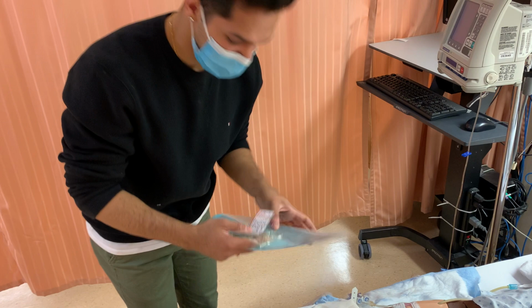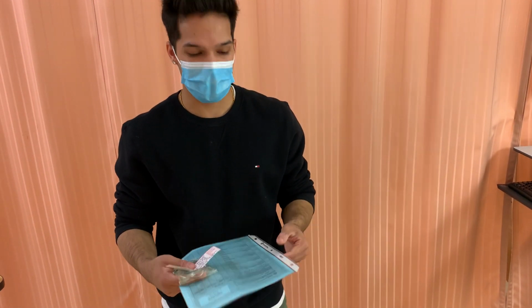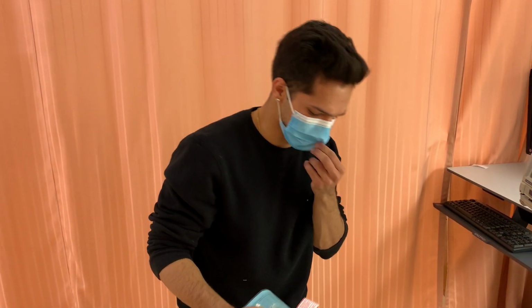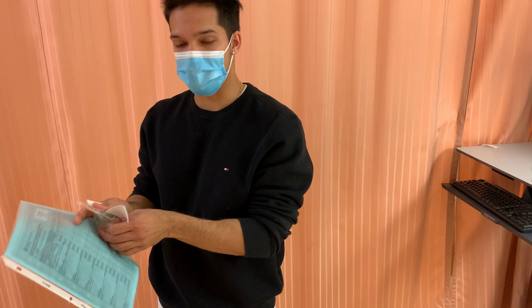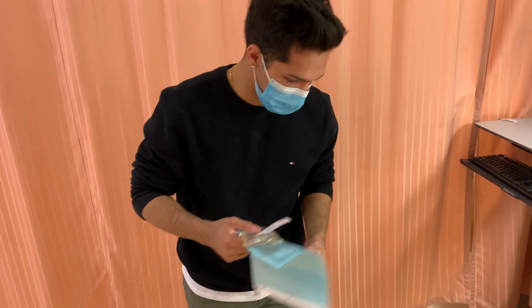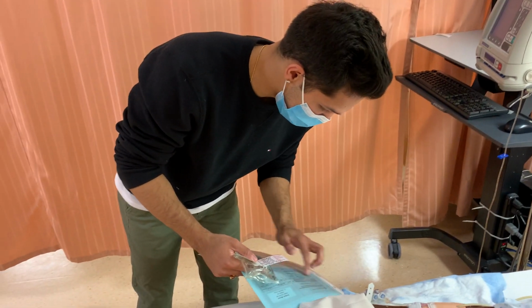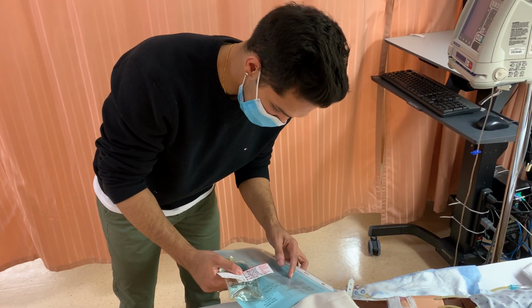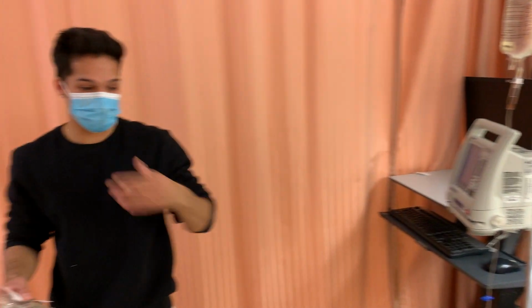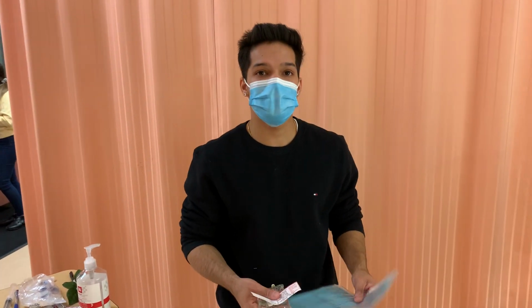For the recipe I needed 100 units, which is equivalent to 1 mL as per the vial. Therefore I have 101 mL in here, and the final concentration in the bag is 0.99 units per mL. The right route for this medication is IV, continuous IV. This is the IV bag, and we'll be putting it through the Baxter pump, which is regulated through the patient's intravenous line. The medication is due to be given today, now.